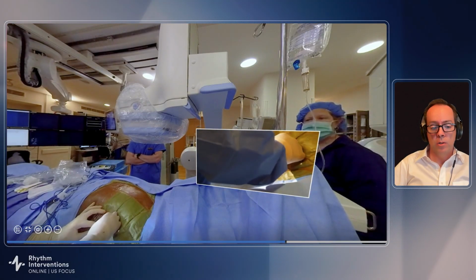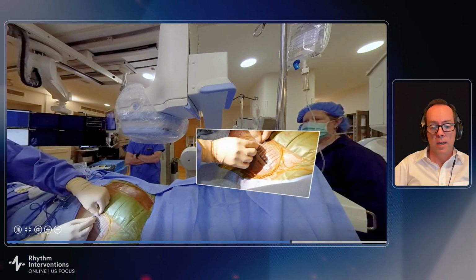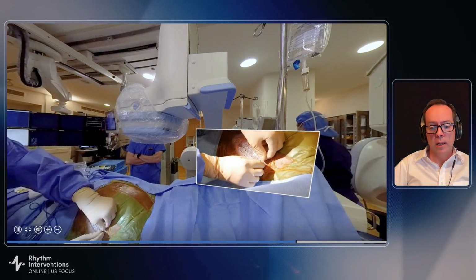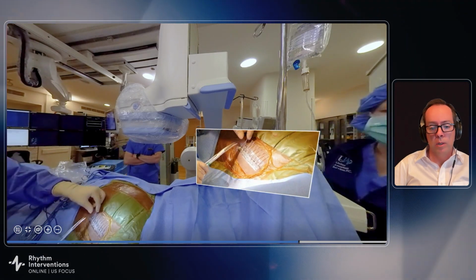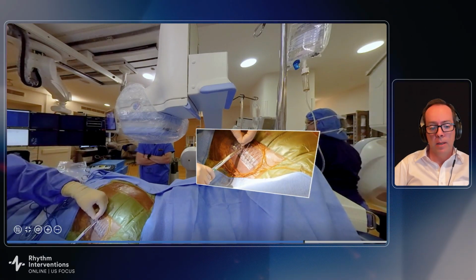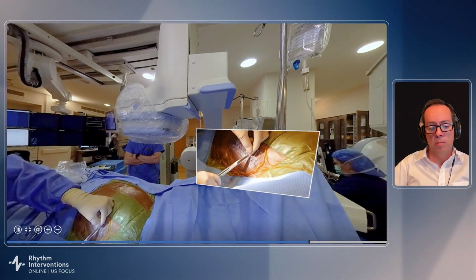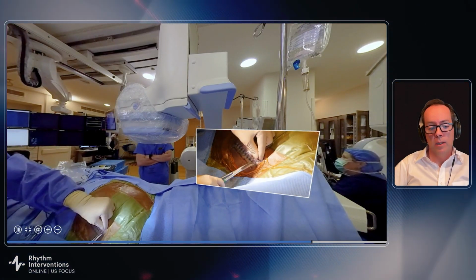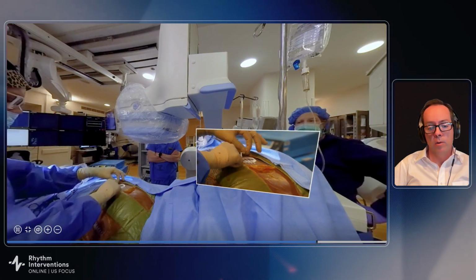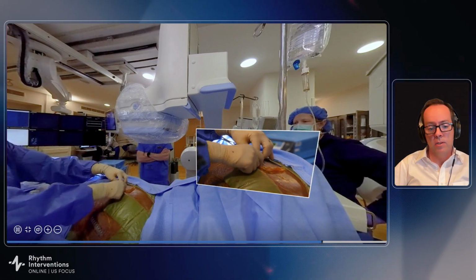For the superficial skin closure here, he's using this zipper thing. It's a pretty nifty, locking sort of device. In our labs we use glue to allow them to take showers right away. For my female patients, the direction of that incision is important. Following Langer's lines, following the creases, is critical.